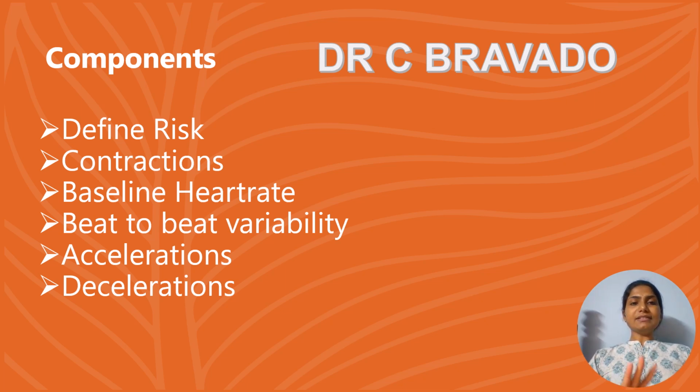The fourth is when the mother is on any beta mimetic drugs or parasympathetic blockers. These drugs also will cause fetal tachycardia, and rarely fetal arrhythmias like atrial flutter or ventricular tachycardia will also result in fetal tachycardia. So if the FHR is more than 160, it is called fetal tachycardia.